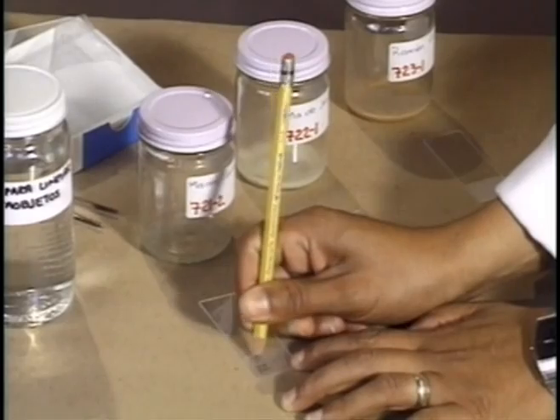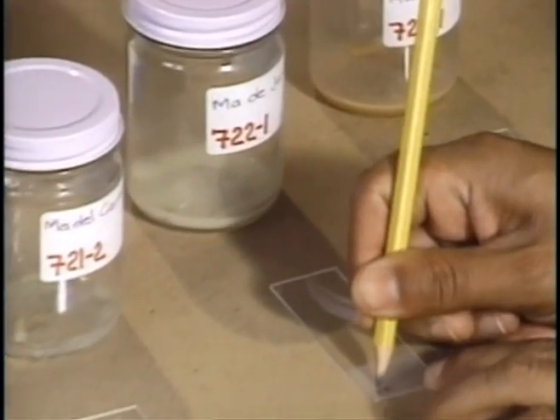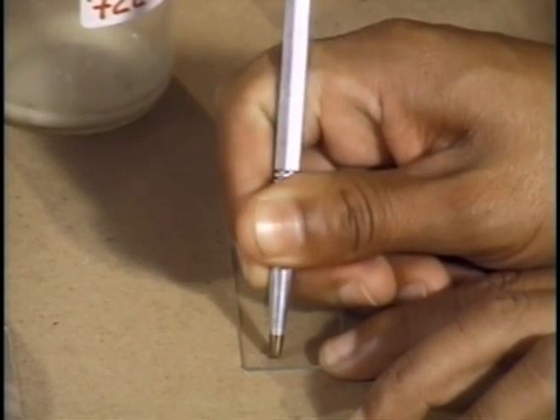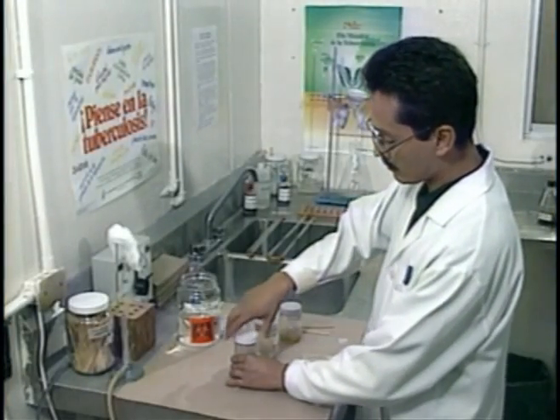Properly identify each slide with the laboratory and specimen number. Use a lead pencil to write these numbers on the frosted end of the slide. If the slide is not frosted, engrave the laboratory serial number using a diamond-pointed stylus. Never use a grease pencil, since markings could wash off during the staining process.